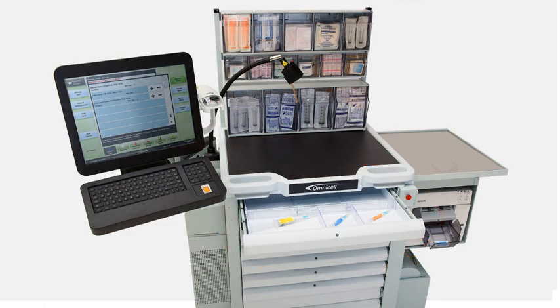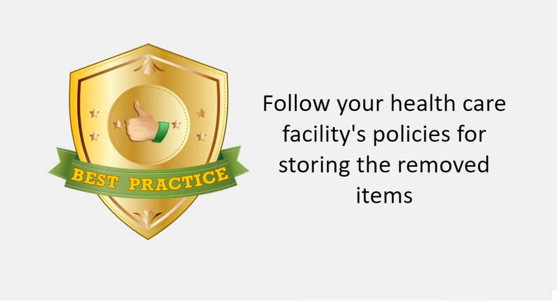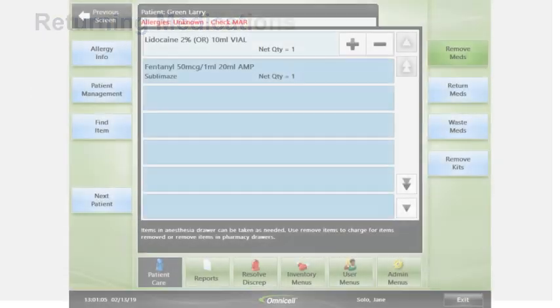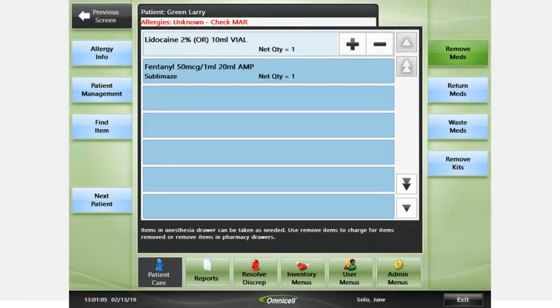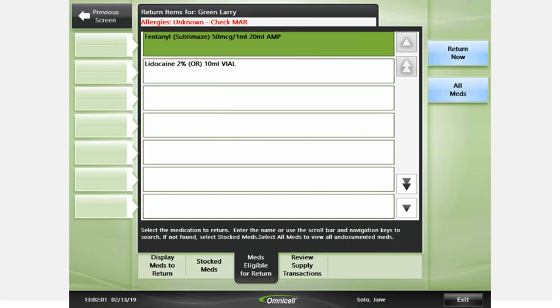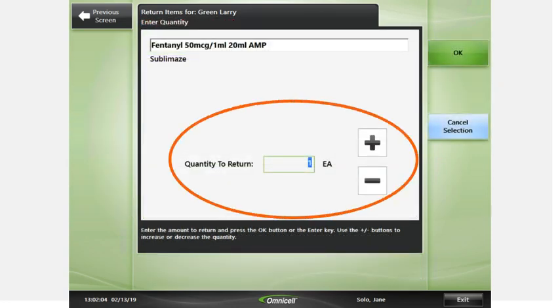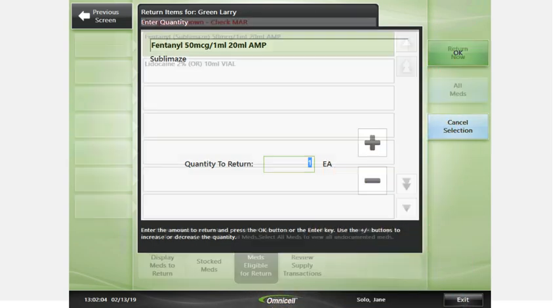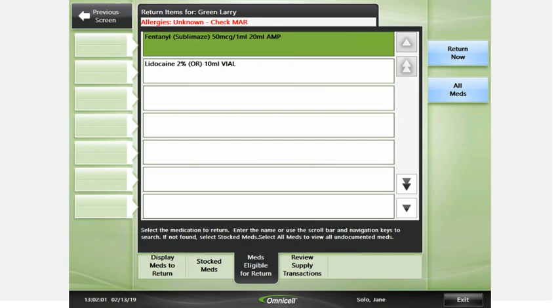If you do not have an anesthesia work drawer, follow your health care facility's policies for storing the removed items. You may return items not used in the case two ways. For narcotic medications, start from the patient screen and touch the Return Meds button. The meds eligible for return list displays, showing all meds you have removed for that patient. Touch the item in the list to view or modify the quantity to return. The return quantity is auto-populated with a quantity of 1. Make any changes and press OK. Select the medication or medications from the list and touch Return Now.